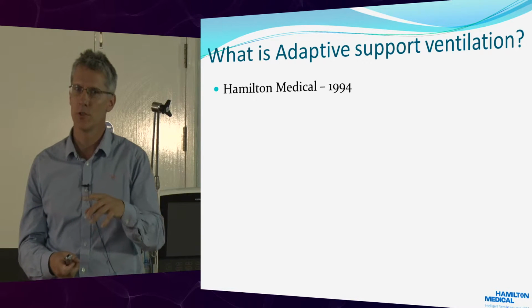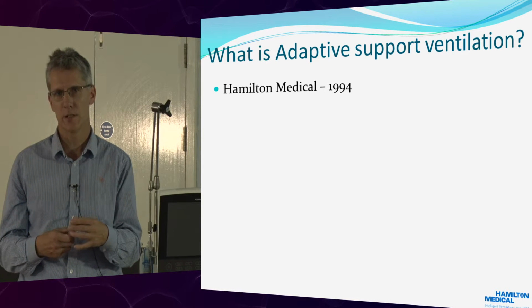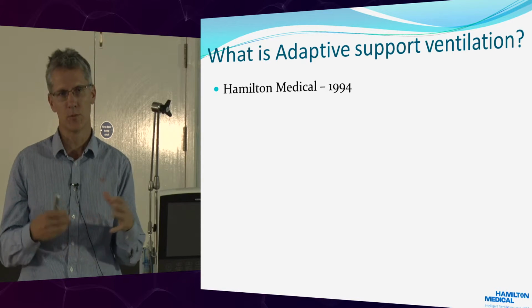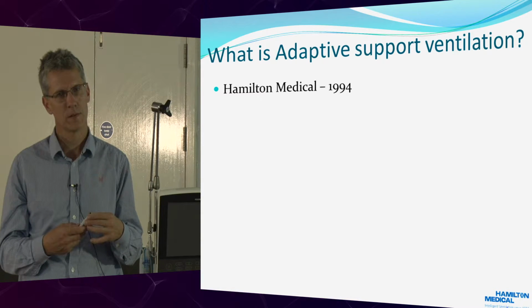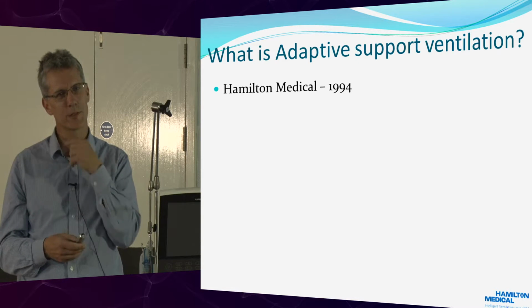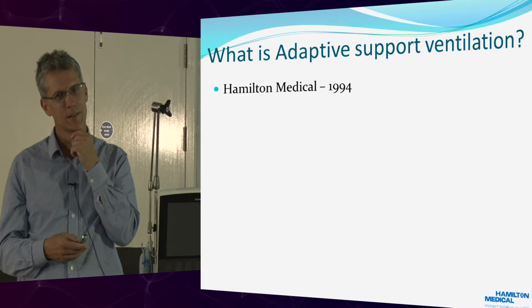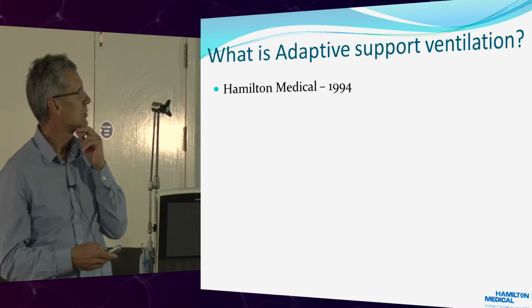So do you use it when you're trying to wean people? Yeah, initially. So you use it more as a weaning tool? Yeah, once they're starting to breathe quite a bit, you'll swap to pressure support for the final wean. So you wean them on pressure support, okay. Yeah, we go from ASV to pressure support. Okay, cool.